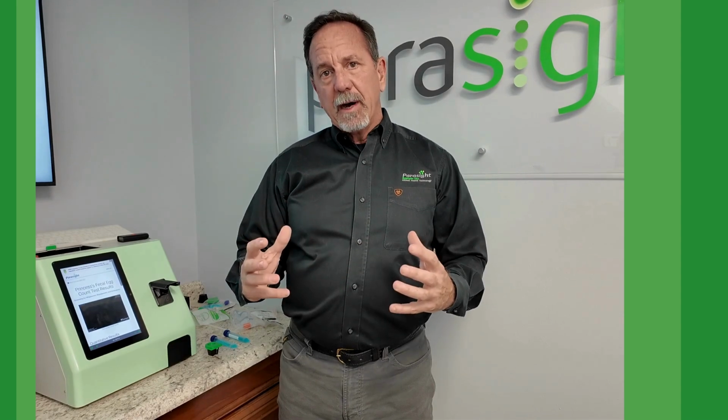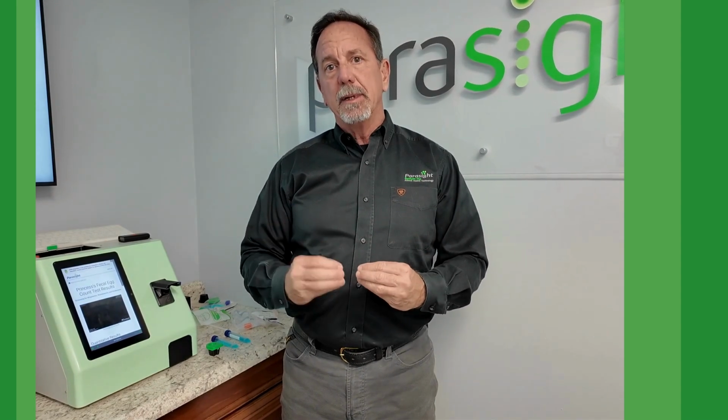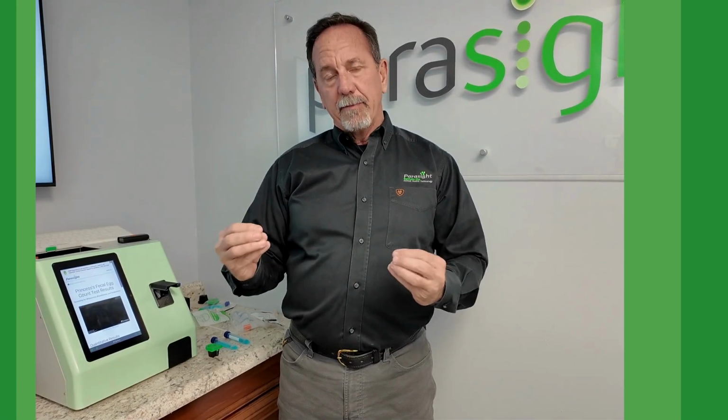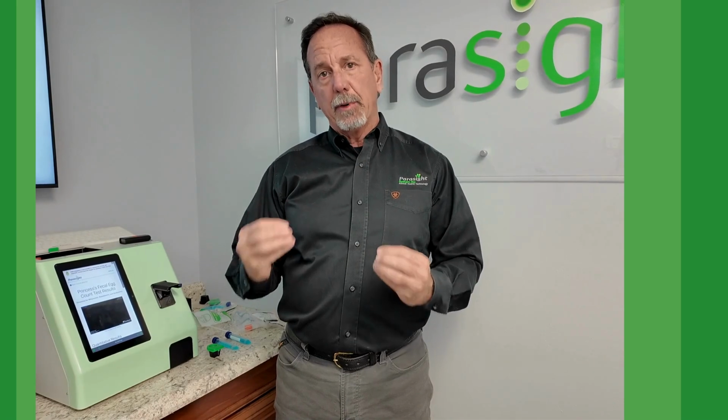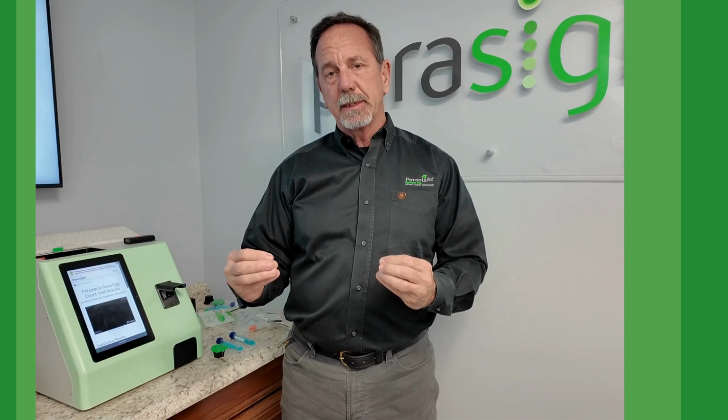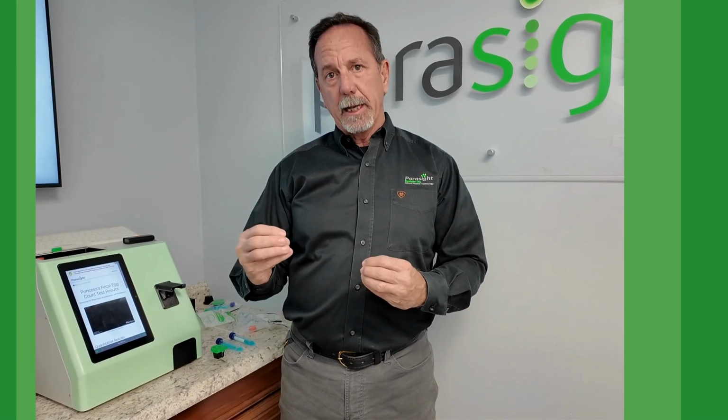We do have to modify what we're doing because we have to get the lipids or fats out of the sample and separated from the eggs. And so the process that we're going to use is just to add a few additional steps to get the lipids out of the sample.